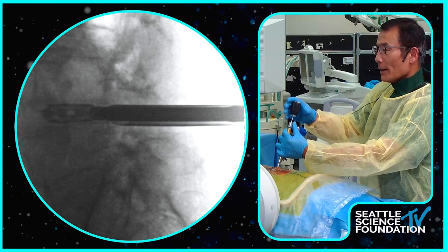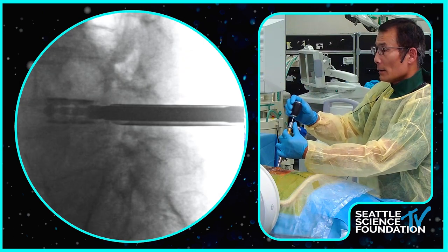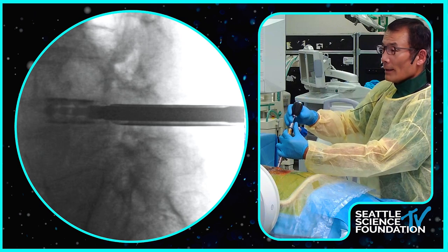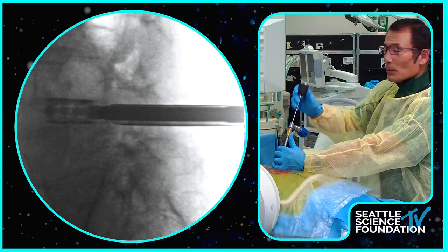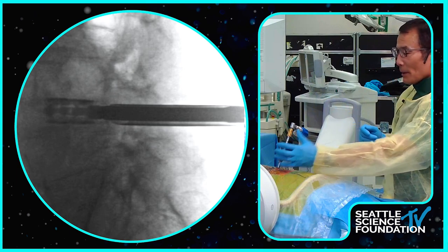And at this point, you can also hammer it anteriorly where you expand it. Take a shot there. Yeah. That's pretty good. Take a shot there. Wow. I think I'm going to stop there. Otherwise, I'm going to crash the end plate. Okay, let's take AP. Let's see where we are.